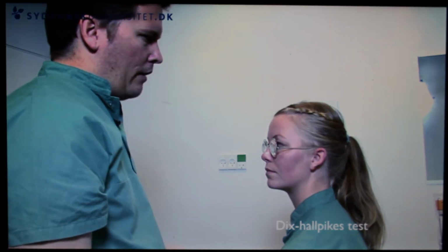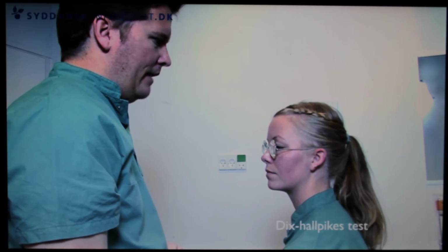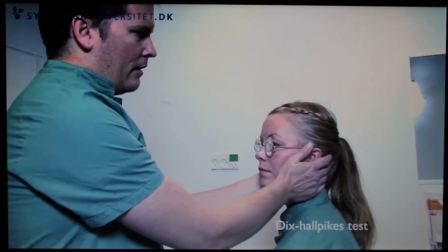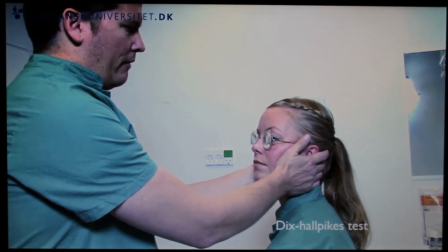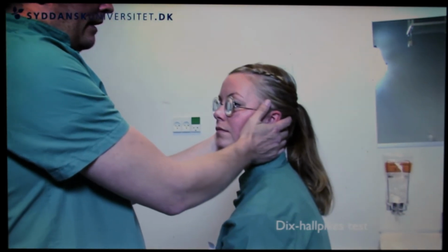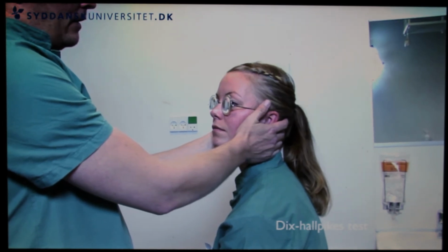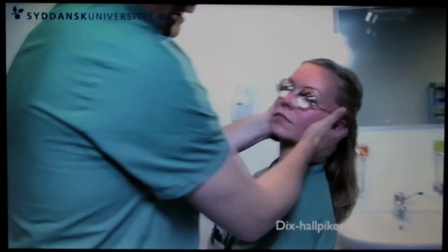In the test I'll show now, I'll test the left posterior canal for BPPV. The patient wears Bartels' or Frenzel's glasses or similar. The examiner turns the patient's head 45 degrees toward the left ear, and in a smooth, however quite fast movement, the patient is lying down on the back on the pillow like this.